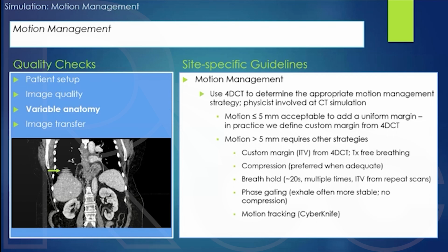And if the curvature of the body is so different, then you may not want to use it. So there is no absolute answer at what level, but it's really a judgment of what you use this MR or PET for in the contour, and whether you have confidence that the area you are interested in is accurate enough for the contour.